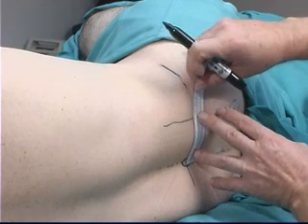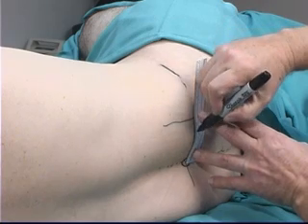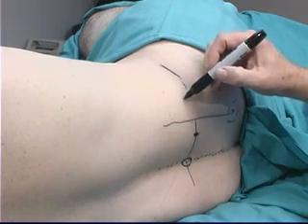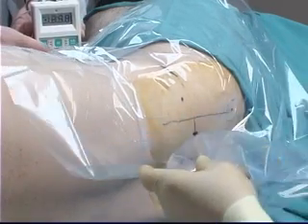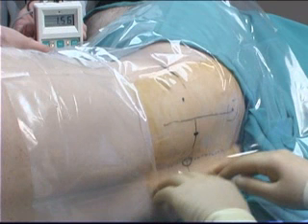Two-thirds of the distance from the midline on the intercrestal line, as indicated here, is the point of needle entry. The second marking, made lateral, is where the catheter is anticipated to be tunneled. The skin is prepared with an appropriate antiseptic solution and the area covered with a transparent fenestrated sterile plastic drape. The area is now ready for the procedure to begin.